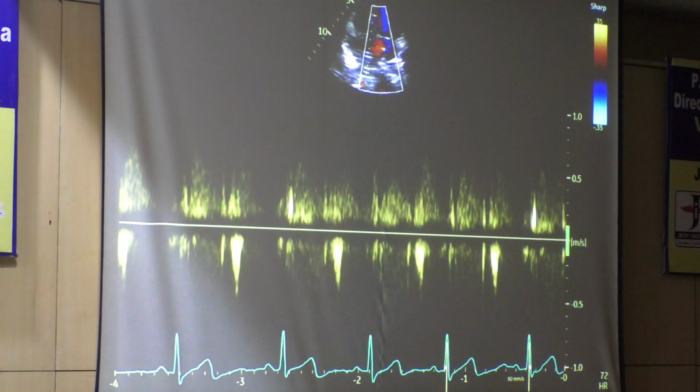So many other things you observe start telling you right in the beginning, look, something is wrong with this child. And it's not only that pulmonic venous flow is increased, a shunt is present. Even in a patient who has a significant lung infection, we have seen the pulmonic flow on the higher side a number of times. So just be cautious about what exactly we are looking at and dealing with.